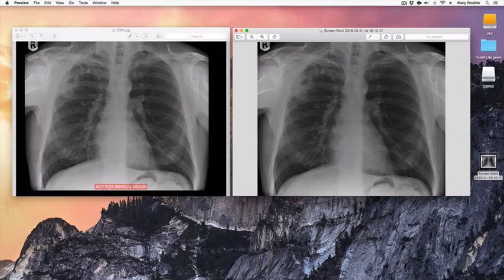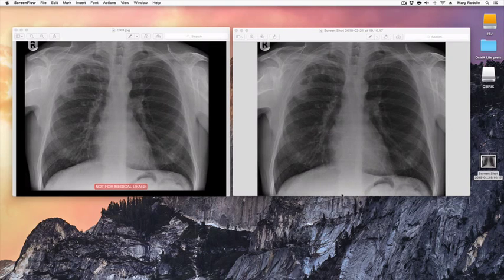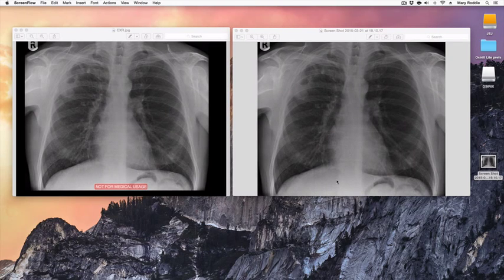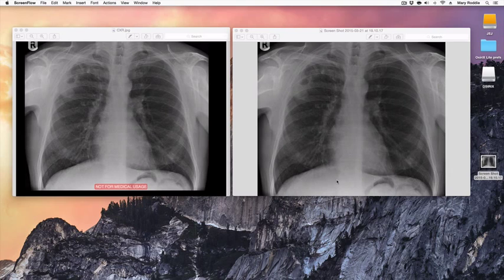Here on the desktop is the original JPEG that I exported, which has the 'Not For Medical Usage' logo. On the other side of the screen we have the unannotated screen grab, which can be imported into a PowerPoint presentation or document for teaching purposes.